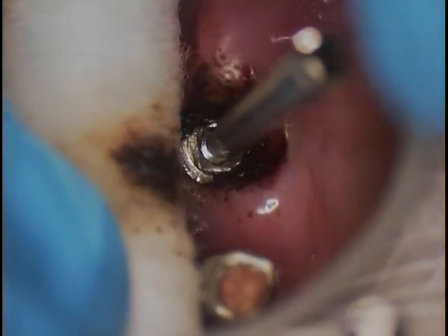Now we're feeling the threads. The first time you go in there, you can feel there's a little obstruction, not quite going all the way through. There's something binding, and we really want to be able to get the threads completely down through there. There's some blockage, so we don't want to commit.